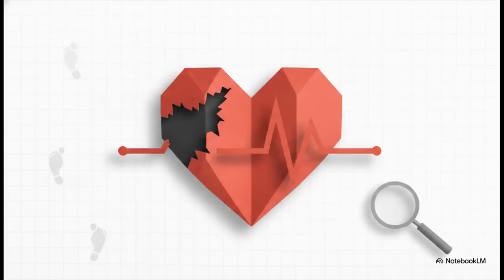But what if we're too late? If we don't intervene in time, the ECG leaves us with these permanent scars, pathologic Q waves, and a massive loss of R wave amplitude. This definitively signals that the muscle tissue has necrosed. It's dead, and it's permanently lost its electrical charge. The detective's trail has basically gone cold.